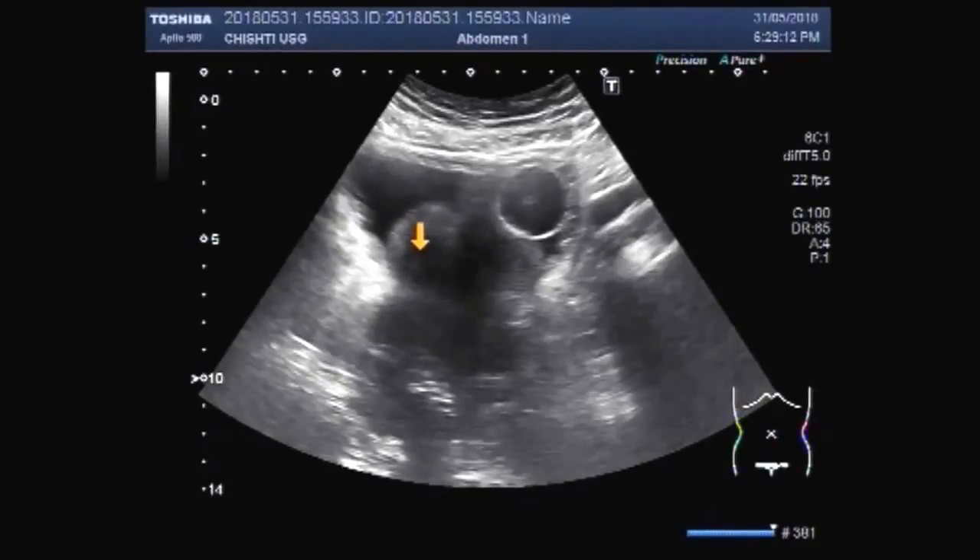This ultrasound video shows an enlarged prostate. You can see the urinary bladder, prostate, and balloon of the catheter. This is the balloon of the catheter.